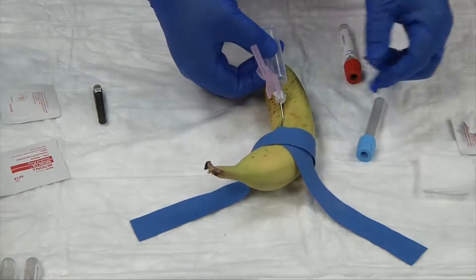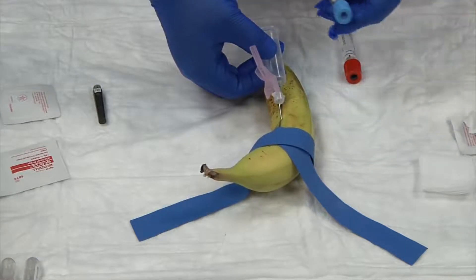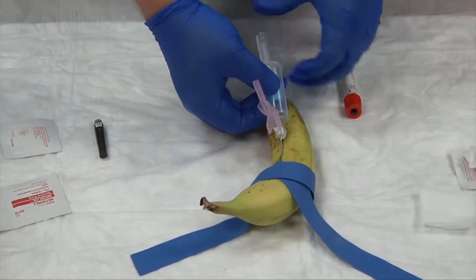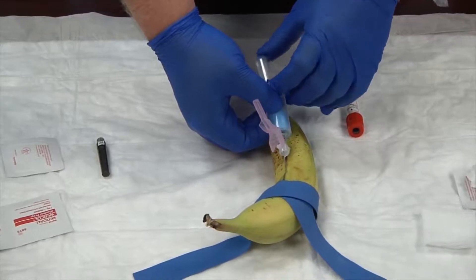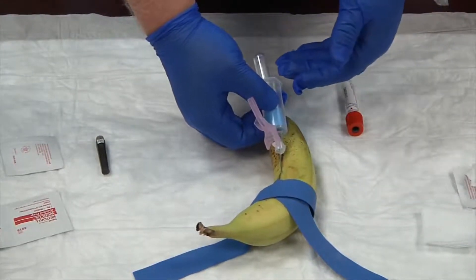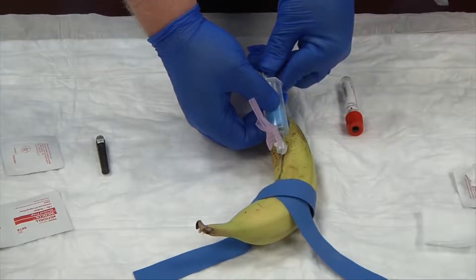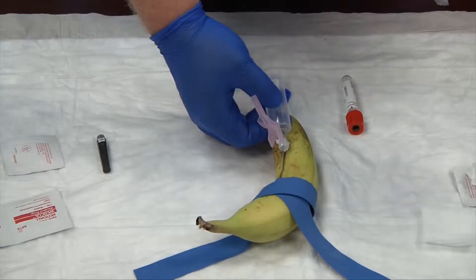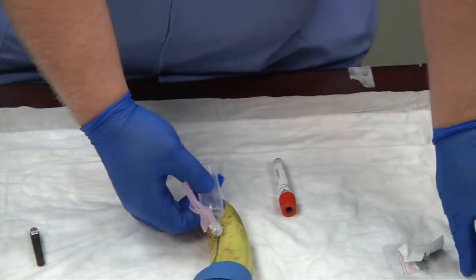Now I'm in my vein. I'm going to let go of my anchoring — my non-dominant hand is going to do the work now. I'm going to insert my blue tube first with the label side down so you can see the blood come in. For this demonstration we're going to pretend blood is flowing into the tube. Once it's full, pull it out gently, trying not to let your needle move, and invert it slowly three to five times, then set it down.